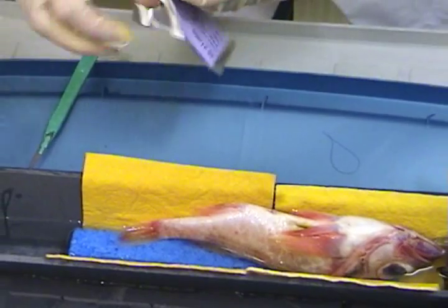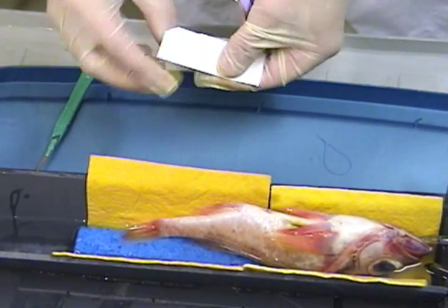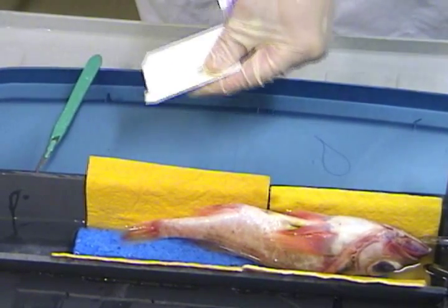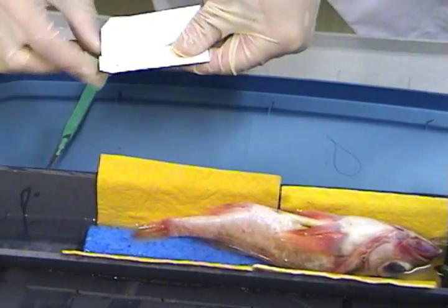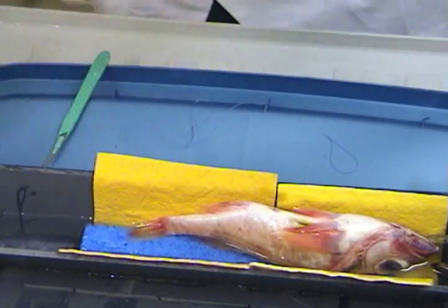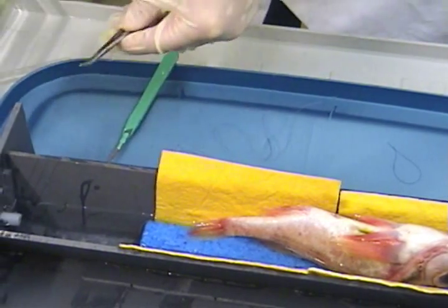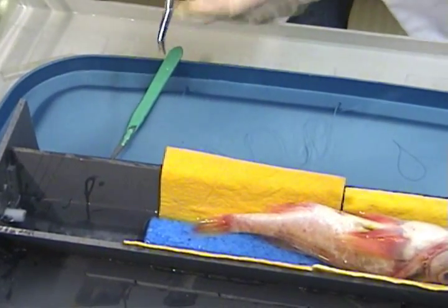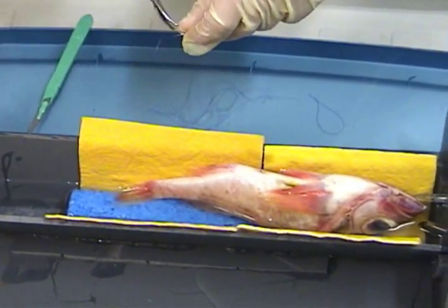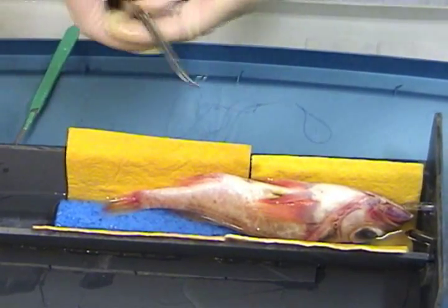So now let's close the incision area. There are several types of suture material that people use, for example, catgut, braided silk, and monofilament. For small fish like salmon smolts, I suggest a suture diameter of 4-0 or 5-0. For larger fish, a 3-0 or 2-0 is a good choice. For this fish, I'm going to use a 3-0 monofilament suture. The number of stitches required is a decision that you have to make based on the size of the incision and the species. For a V9 transmitter, my preference is two simple interrupt stitches and I use a traditional surgeon's knot technique that most researchers use.